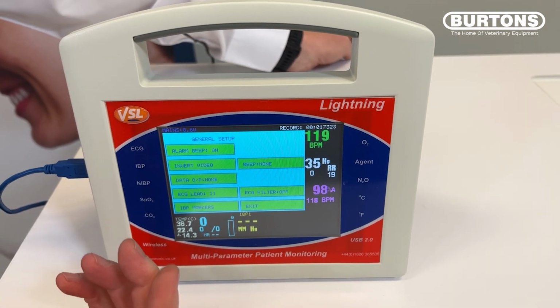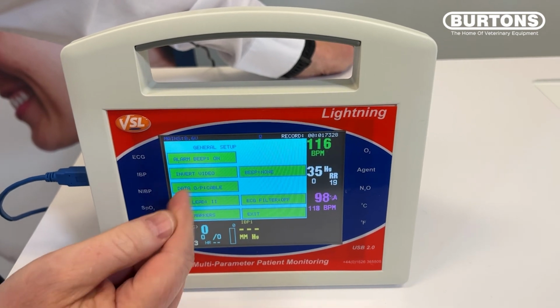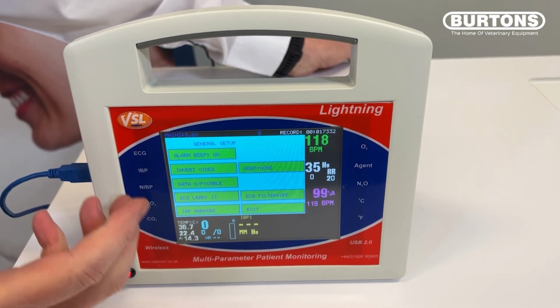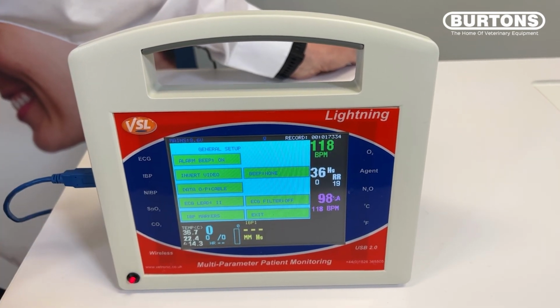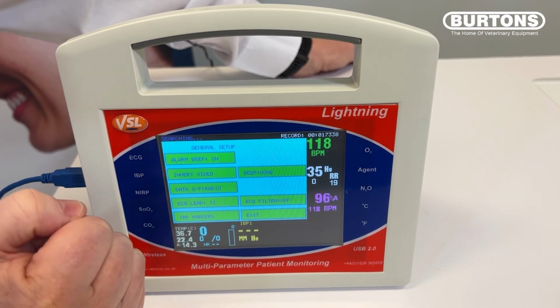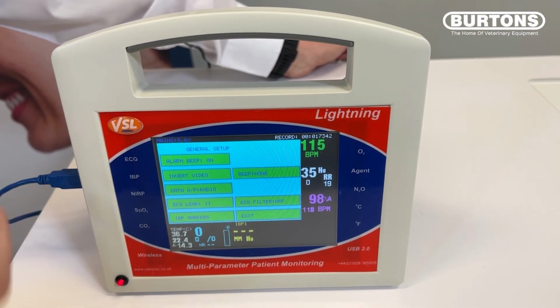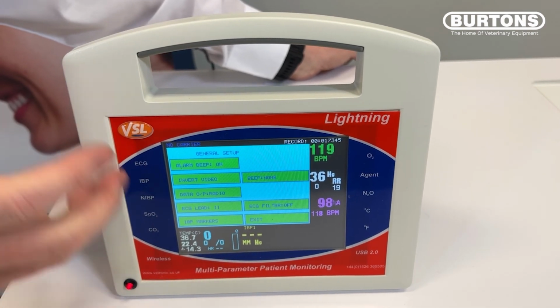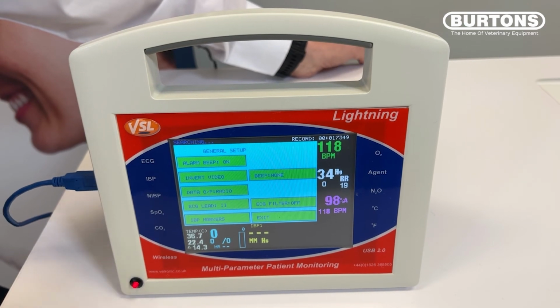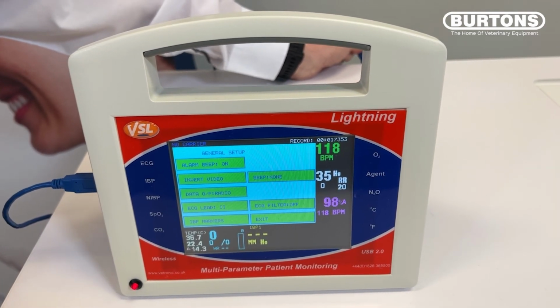There are a number of options, as you will see. If I touch it once, it says output cable. So this is the setting we need to put it to if we're going to connect the data to a PC using the USB cable supplied. There is one other option. If I touch it again, we can go to the radio, and we can use an internal optional wireless module, which is in fact a Bluetooth module, to connect wirelessly from this Lightning unit to a PC. That's a module that can be fitted at the time of purchase, or again can be fitted later if required.